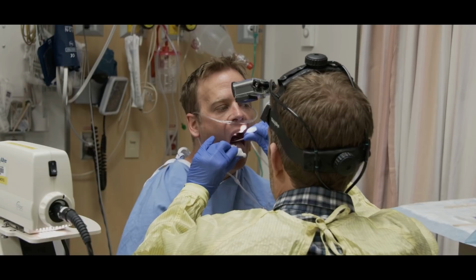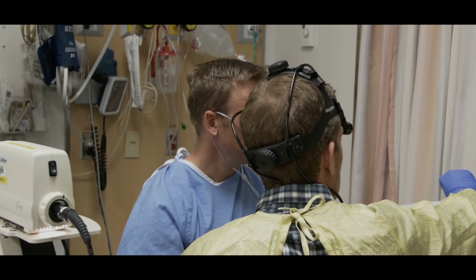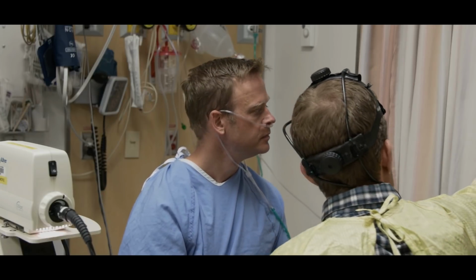Tongue depressors. Lorraine, PCH. Long way back there now. So that's 80 milligrams of lidocaine. We've used one of our tongue depressors. So now we're just going to nebulize. So again, this was 400 milligrams that started in here, Leanne. Okay.